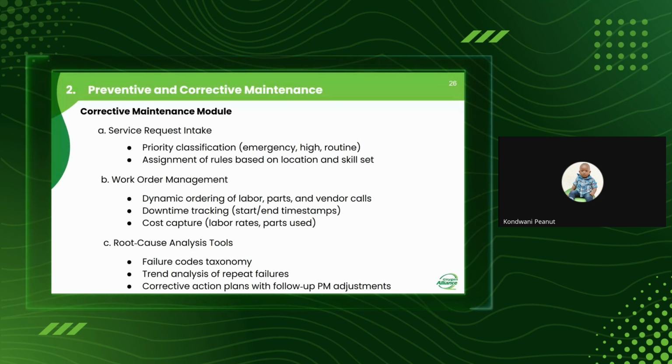So yes, it's important to incorporate these small devices throughout their life cycle. And sometimes it comes to the issue of safety, because these are portable devices. People can simply put them in their bags and pockets, and off they go home, and they use them at home. Maybe they have private clinics. So if we omit these devices, we'll still incur high cost, because we are not able to trace small devices that really matter in the provision of health services to the facility.